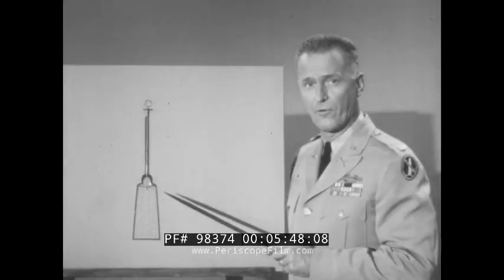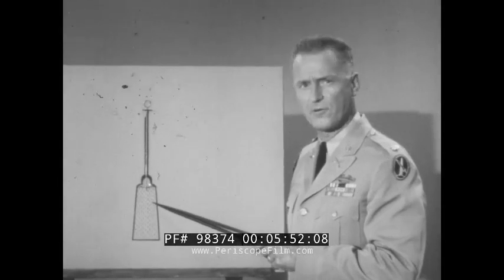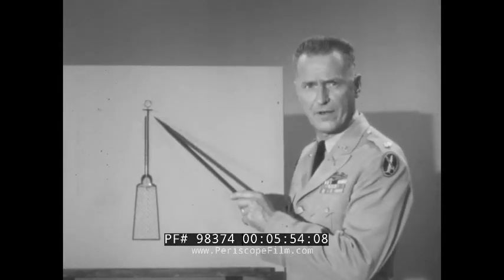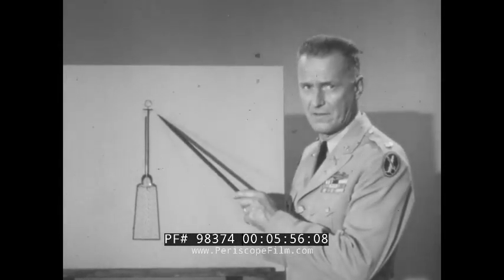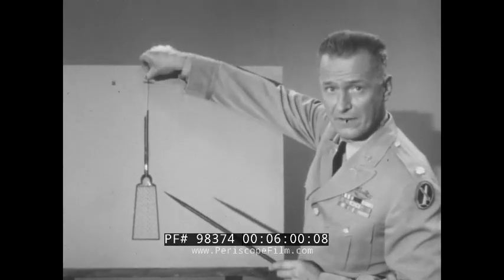If you only thought you broke the seal and then discarded the wire stylet, or even if you just pulled the wire out without checking, you would never be able to stick the wire back into the fine-caliber needle again in time to do yourself any good. Therefore, for your own protection, always check it. Always squeeze a drop of atropine to the needle point. And when you see it, the syrette is ready for use. Then you can discard the stylet.